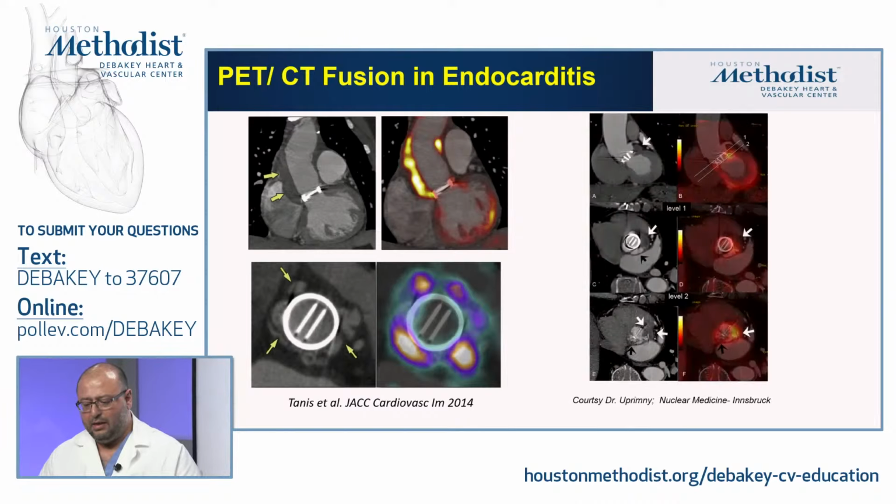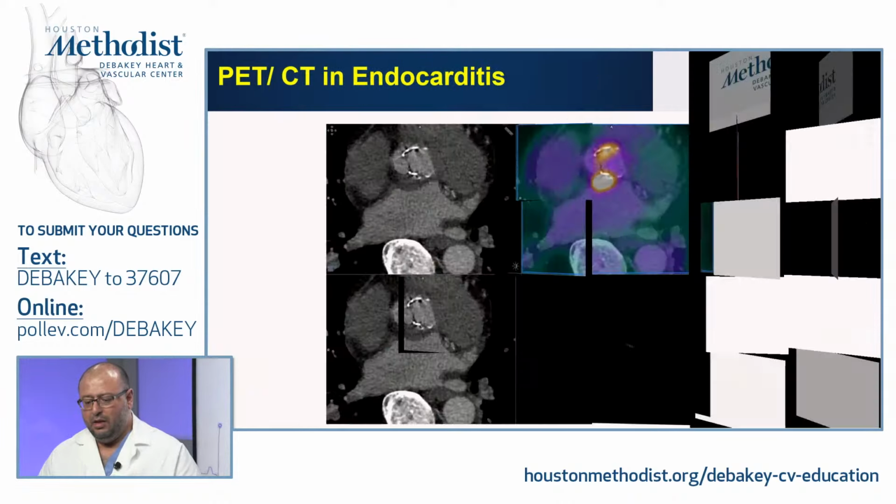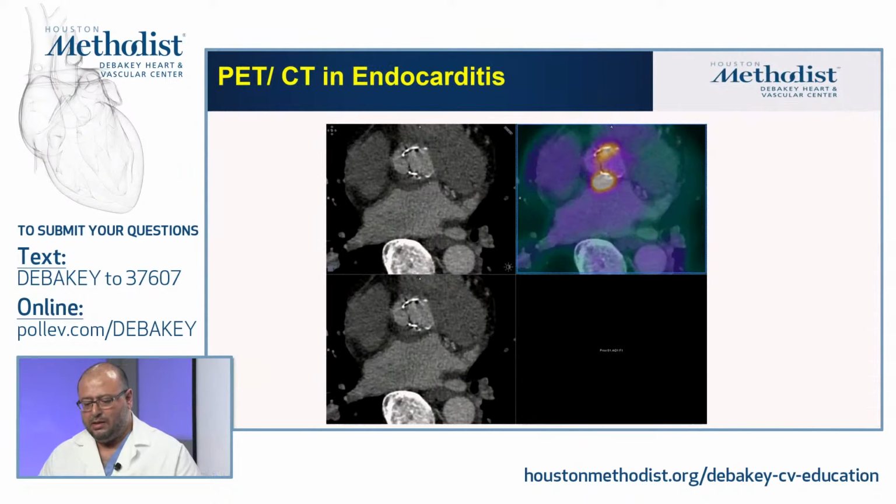And here's yet another patient with an abscess, and you can see it's lighting up by FDG in this area. Now, this is another case from our lab where it was more of an equivocal echo.